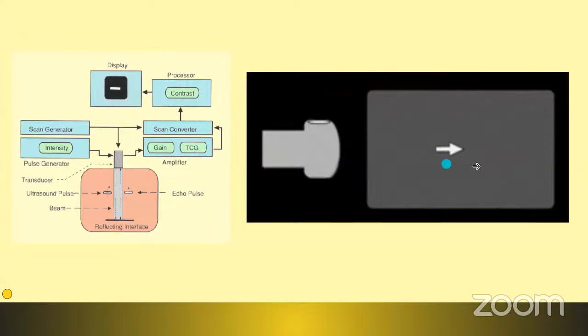As we move across the medium, the more the time taken, the lesser is the energy of the ultrasound pulse. So I am compensating for it by increasing the gain here, finally, to get a brighter image, so that it loses the energy much more slowly. So finally, it computes everything, gives us a contrast image, and we will be getting the necessary inputs.